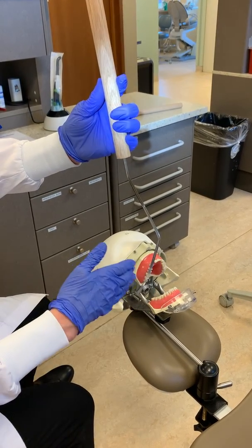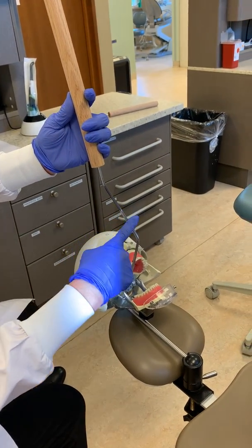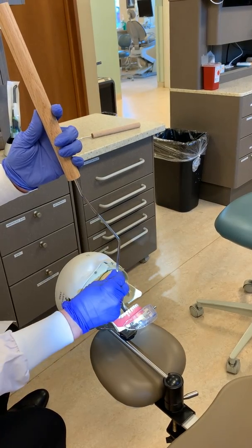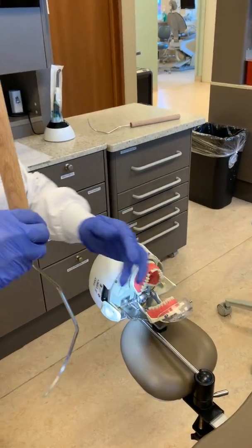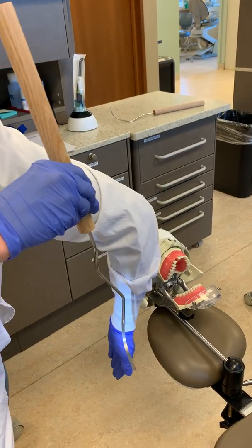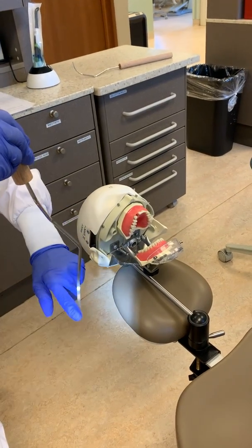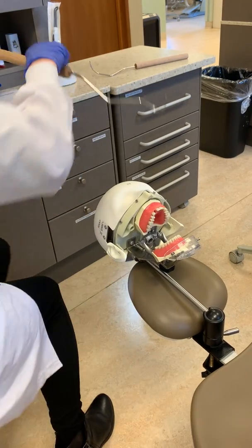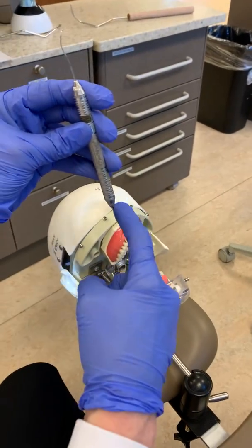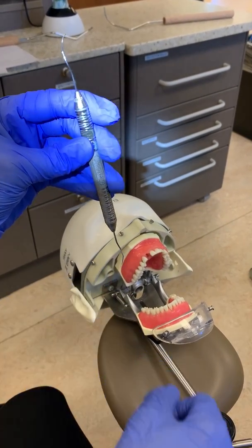I'm going to explain the inside and outside edge so you understand what I'm talking about when I discuss the explorer. If this instrument shank were somebody's arm — this was the elbow, this was the hand — this would be the outside of the arm and this would be the inside of the arm. So on the explorer, this would be the outside edge and this would be the inside edge.